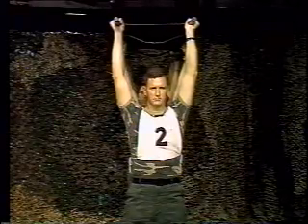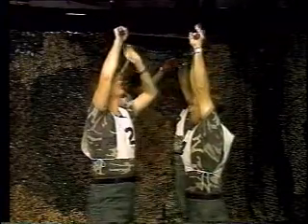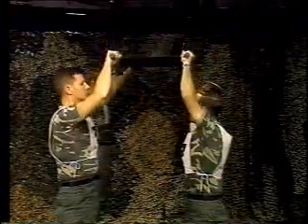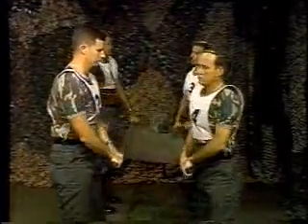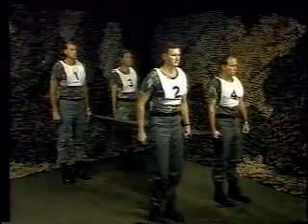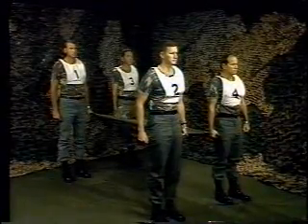Demonstration team. 4-person carry move. Okay, bring it down to your head, chest, waist, all the way down. Notice that they automatically turn and face forward, ready to continue on with their patient. Demonstration team. Lower, litter, recover.